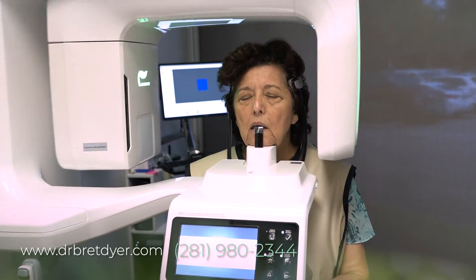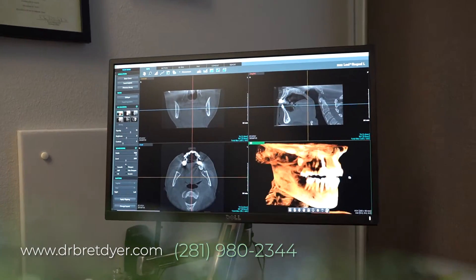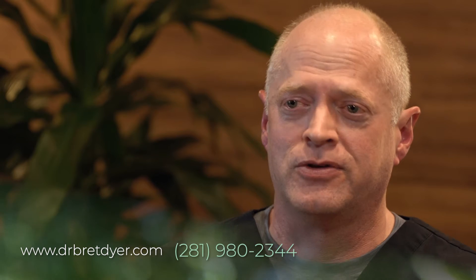The 3D x-ray allows me to see not only the thickness, shape, and volume of their hard and soft tissue in the area we want to place the implants, but all the other teeth too. It also shows me where the nerves are. I want to place the implant in the best dense bone available and avoid any vital structures — I can see all of those on the 3D.